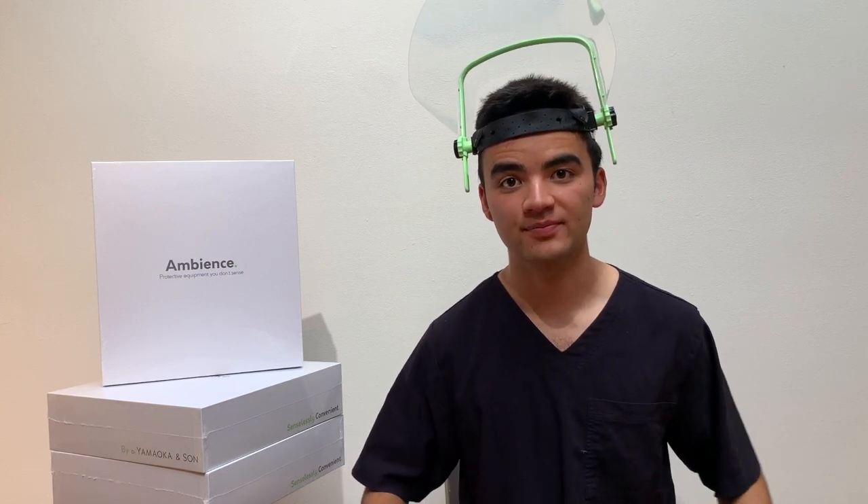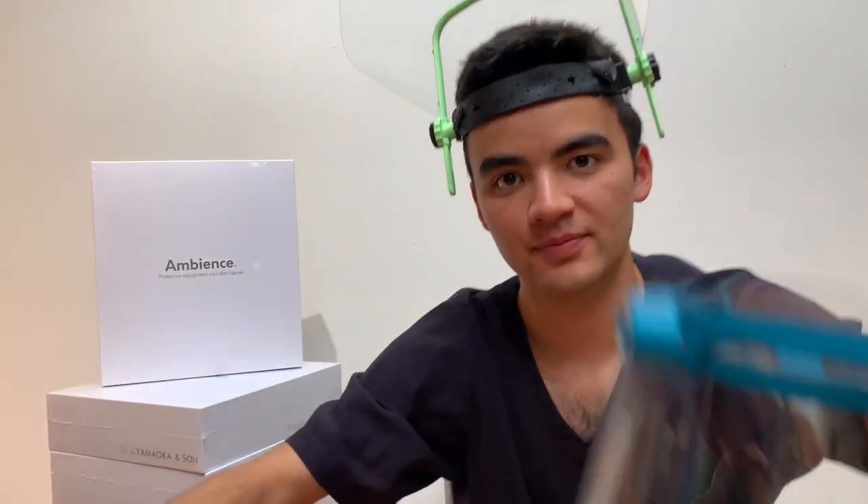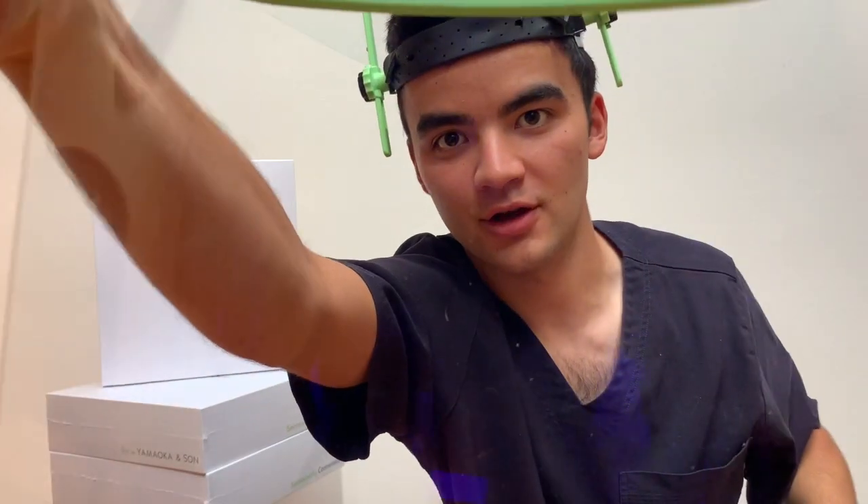For clarity, we have a nano surface optical visor which has 10 times less reflection than a standard face shield. To show you what that looks like, I'm going to show you a comparison. This here is your standard face shield and this here is our optical visor. Standard, optical — big difference, right?